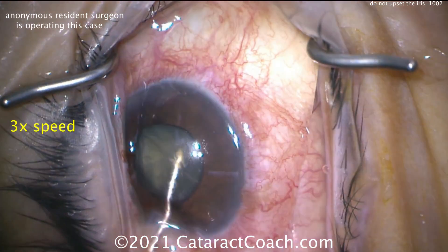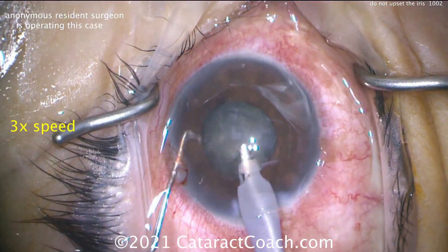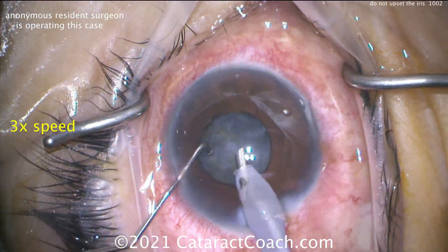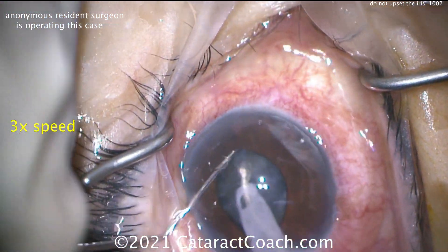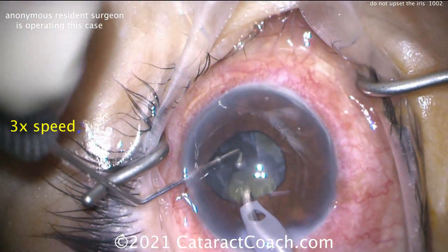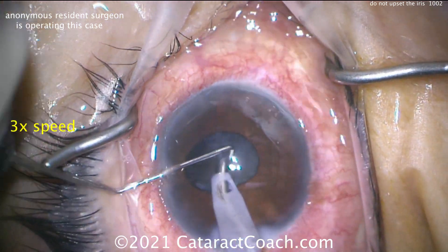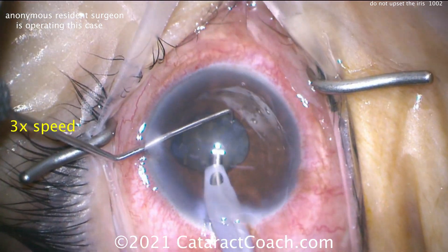Can we bring the nucleus up out of the capsular bag? Not really — we tried but it didn't really work. Let's go with the phaco probe. Phaco probe and the chopper — we need to get this nucleus out now, because the whole nucleus is behind the iris, causing even more issues. As soon as we get the nucleus out of the eye, we'll likely resolve most of the iris prolapse issues. The good news is you operate within that small central area of pupil dilation — probably about a three-and-a-half to four millimeter pupil — and you need to operate within that space to avoid touching the iris.